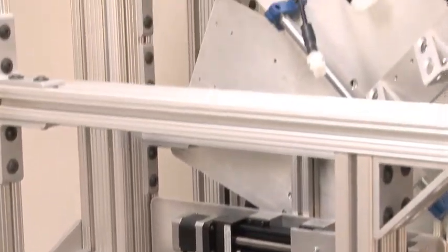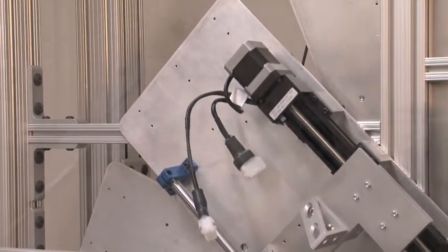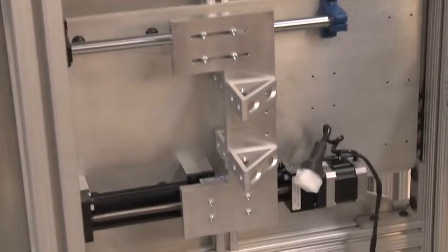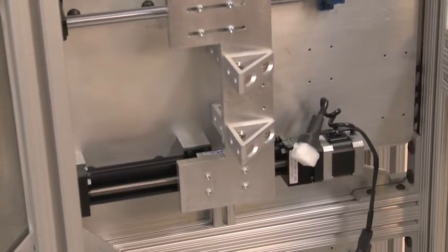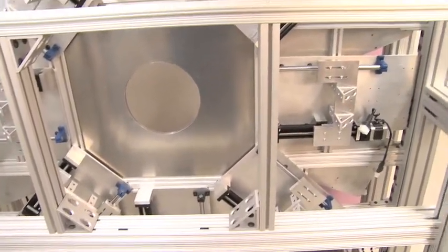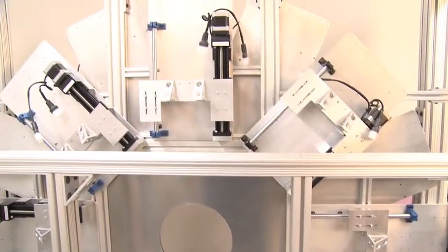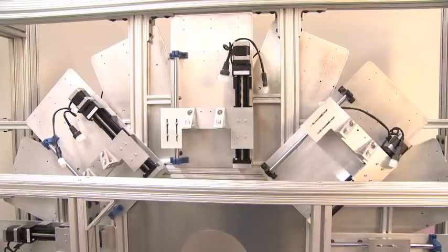It will make a first pass at assessing the data from a so-called scout scan and look at the distribution of activity inside the object and make a decision about where you might want to collect higher resolution or more sensitive data in order that you can make the optimal use of the imaging time spent in the system. The analogy for the human body is a whole body scan where you see broad patterns of distribution, but then the ability to zoom in on a particular organ or tumor or suspected region and get very high resolution data.